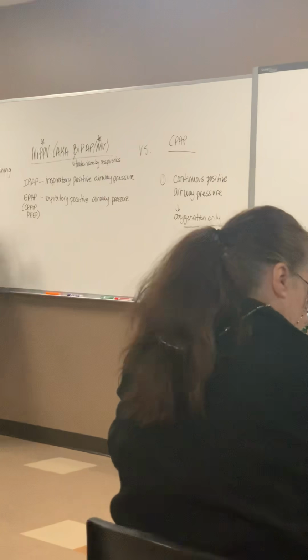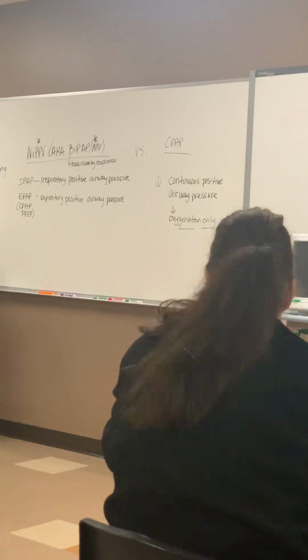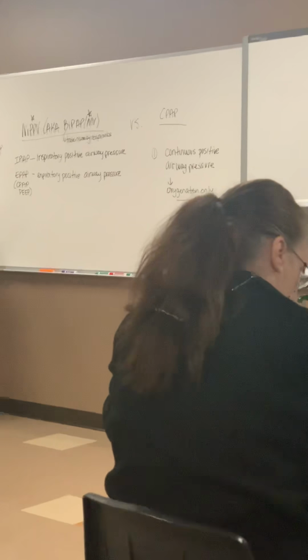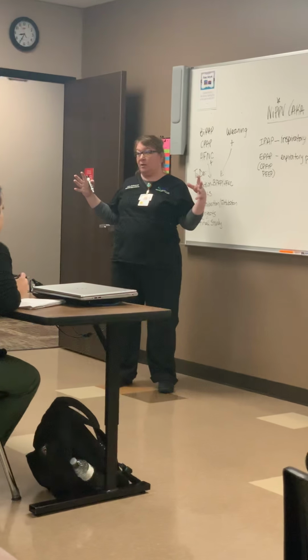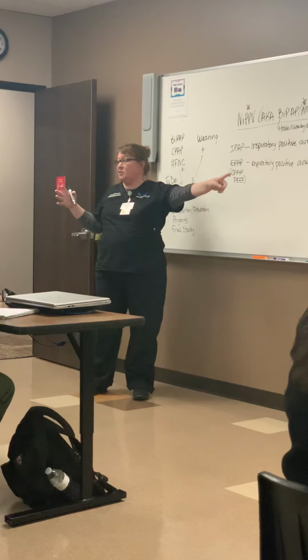Remember in the beginning of the term when I showed the demo with the PEEP on the test lungs, on the pig lungs, right? When we just put PEEP on, was there any air movement? No, it just holds it open. So if your patient's not breathing, it's not going to do you any good. So it's truly meant to mimic PEEP, and it's only for oxygenation.